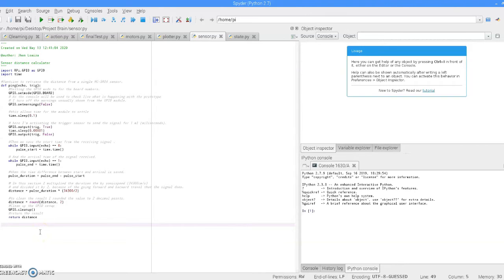The sensor file is the file that contains the function that allows us to retrieve the distance from a single sensor. In this function, we are setting up the GPIO mode to board, setting off the warnings, and allowing a time frame of 0.1 seconds for the module to settle. After this, the trigger part of the sensor will be activated for 1 millisecond. The echo part will save the time when the signal is received and when the signal ends. Once this operation is completed, we can then calculate the total duration of the signal. With this, we can calculate the distance applying the formula. The result is rounded to 2 decimal points, and then the GPIO mode is set to clean up.